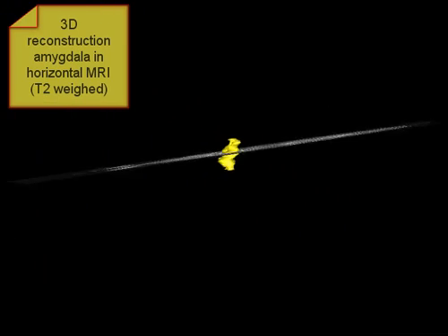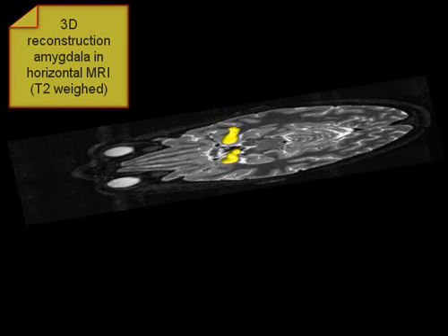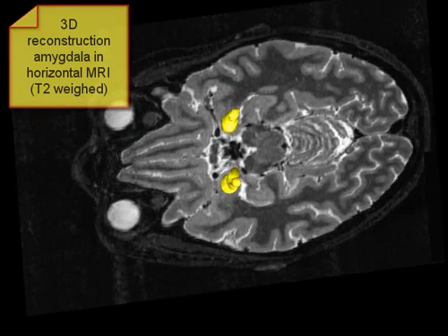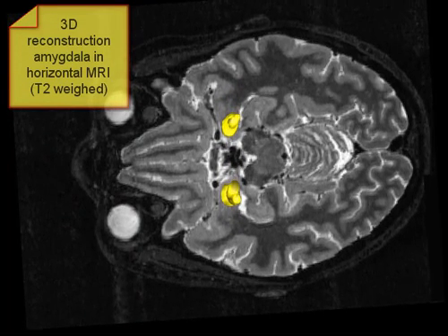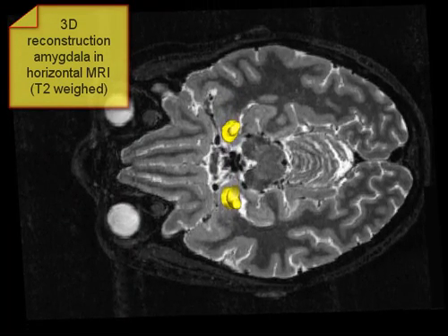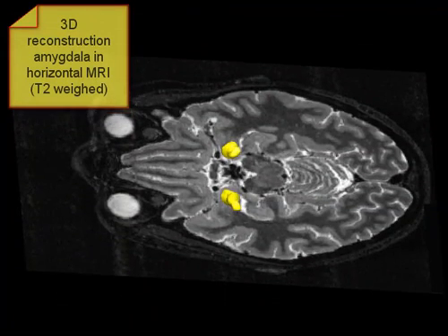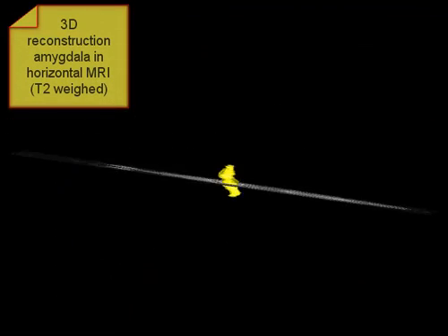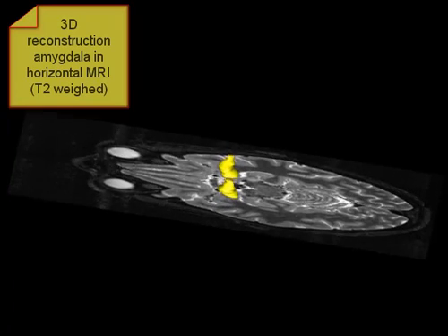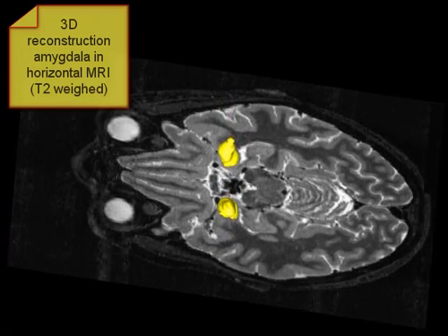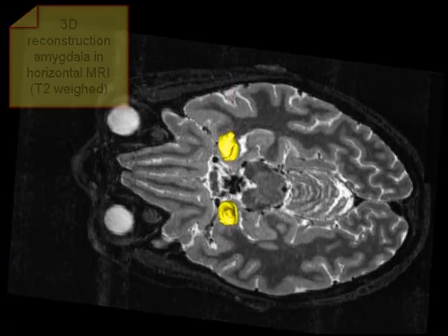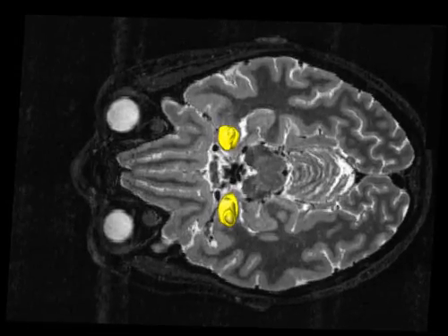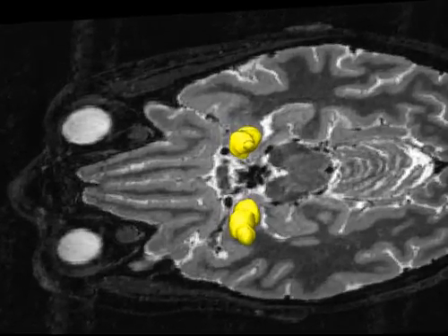The yellow structure in this T2-weighted MRI is a 3D reconstruction of the amygdala. There is a close relationship between the amygdala, which is in front, the tip of the inferior horn of the lateral ventricle, and then, more posteriorly, the hippocampus. Note its medial temporal position.